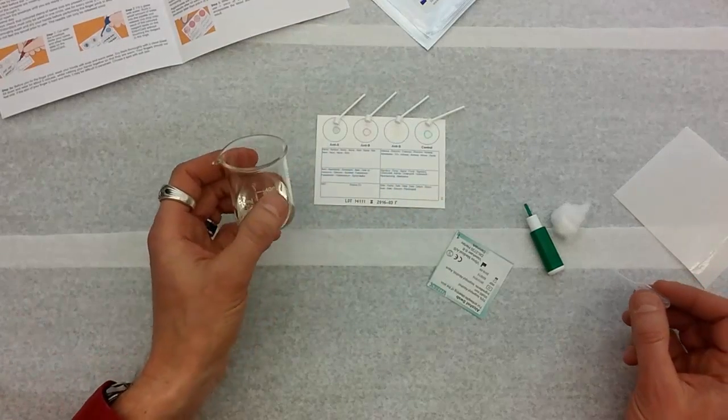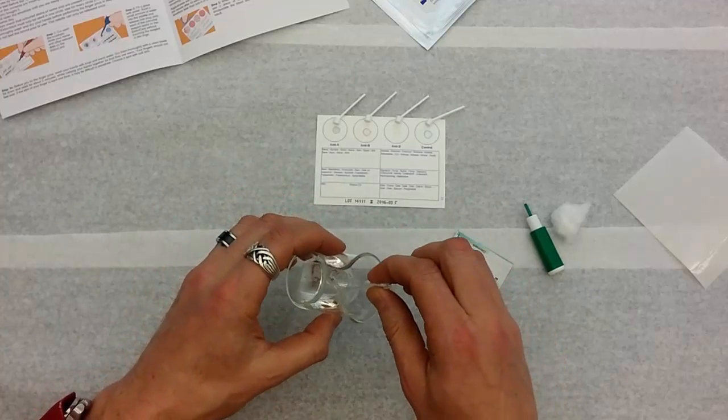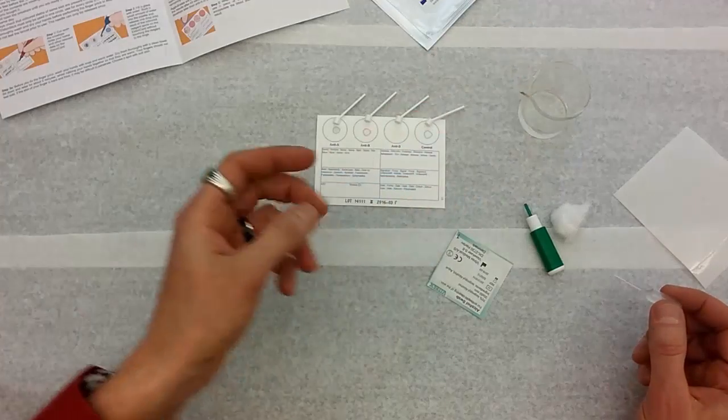There's two things that the kit doesn't come with. One is water. Just a little cup of tap water is fine. And of course the other thing it doesn't come with is your blood, which you'll have to poke your finger to get.